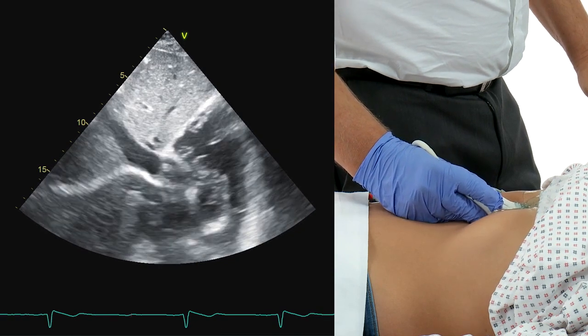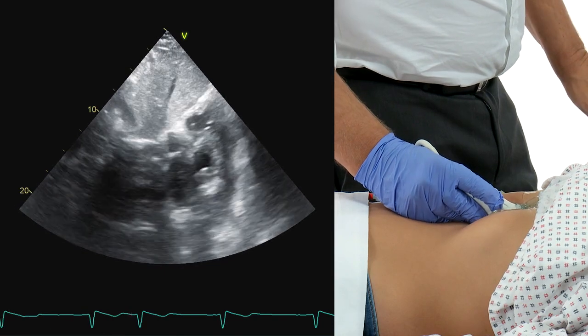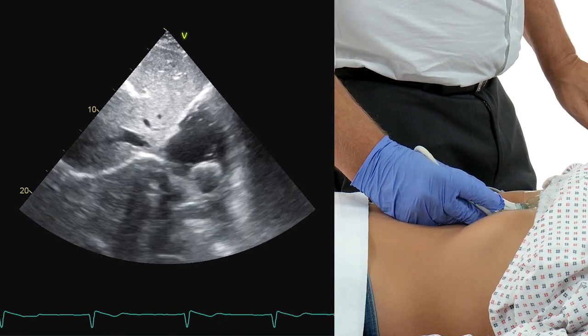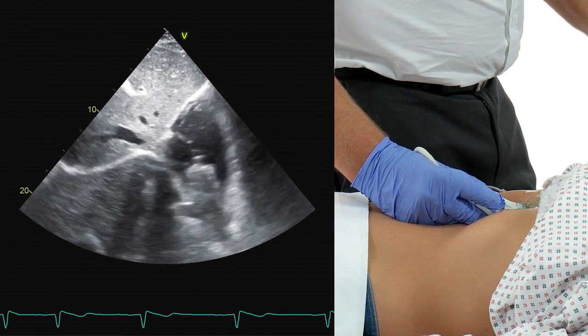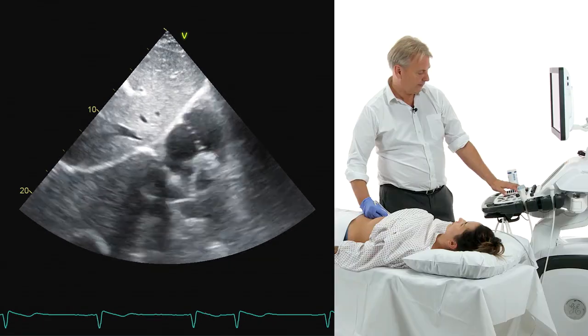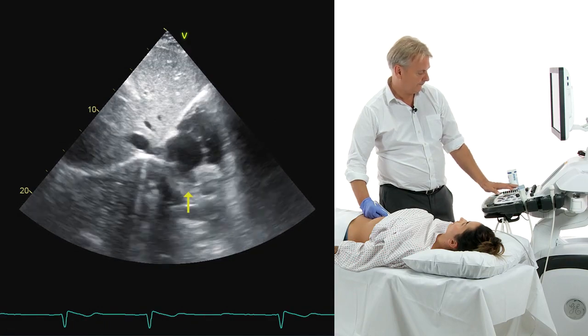By moving the transducer back and forth a little bit, you are also able to visualize the SVC, which comes from the cranial side, from the distant vicinity of the image into the right atrium. Right here would be the SVC.